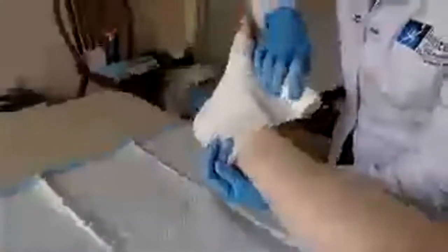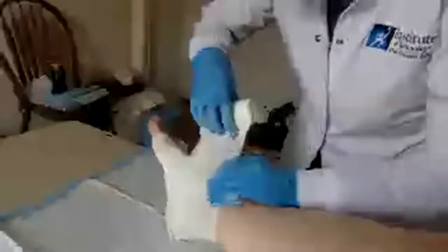Now then, the heel. You want to be very careful with the heel. You want to get one run right down to the very base of the heel. I know I've got that roll in the way. Right down here. And when you do your next wrap after covering this area, you're going to want to bring it right up. You want those edges of the gauze to meet right here. And that is important for flexibility of the foot and for protecting the skin. Anytime there's edema, and when you put on dressings of the sort like this, if there is an open hole area, the edema over the course of the day, that's where the fluid is going to pooch out. It kind of creates an extra balloon area, so to speak.